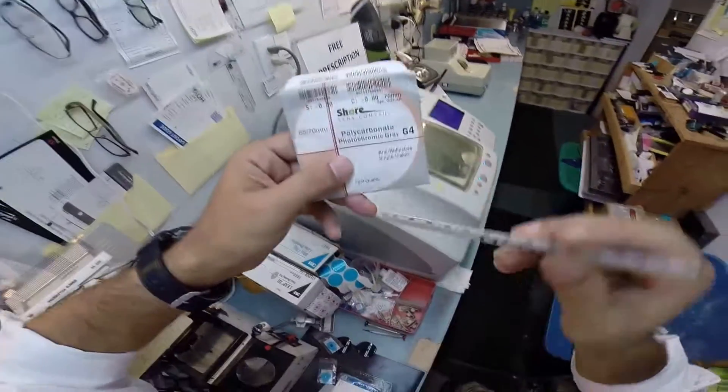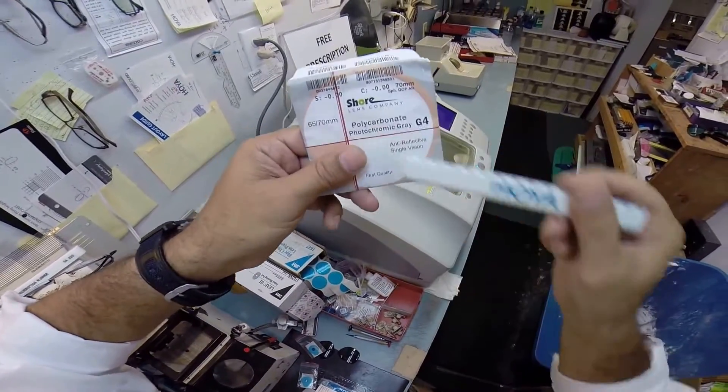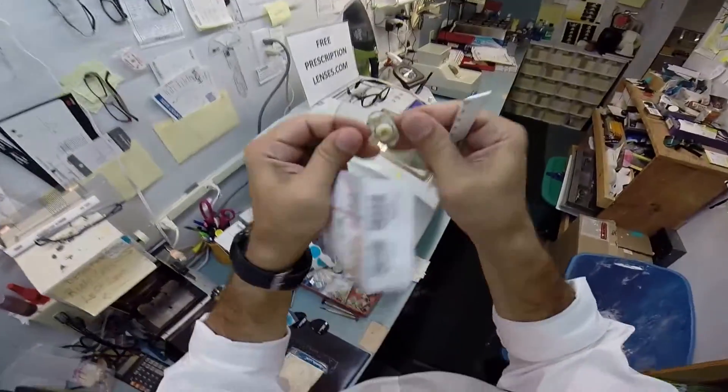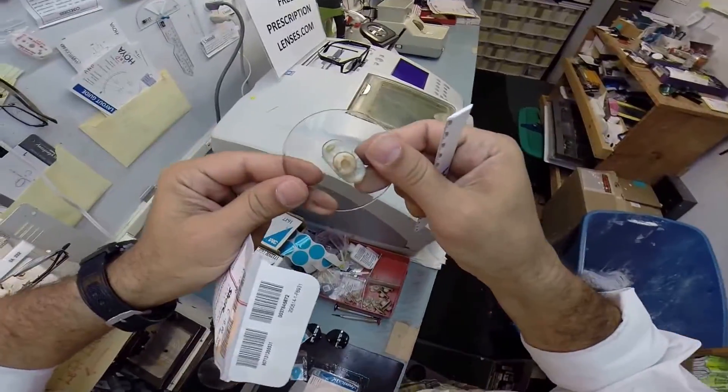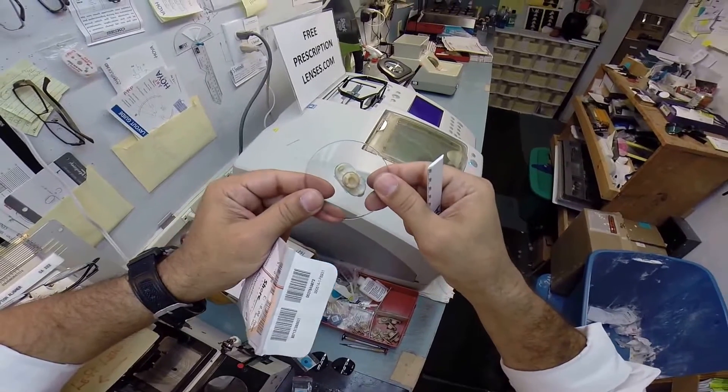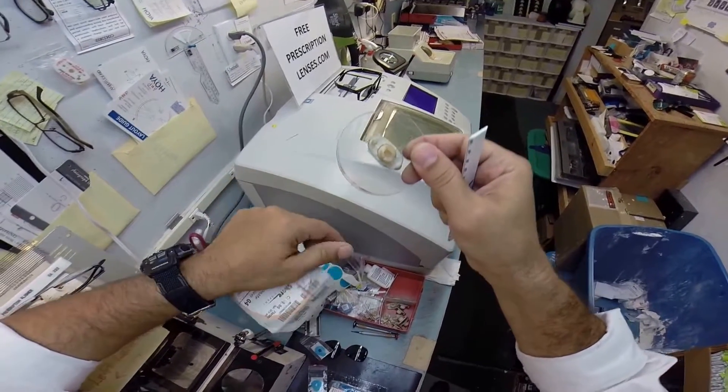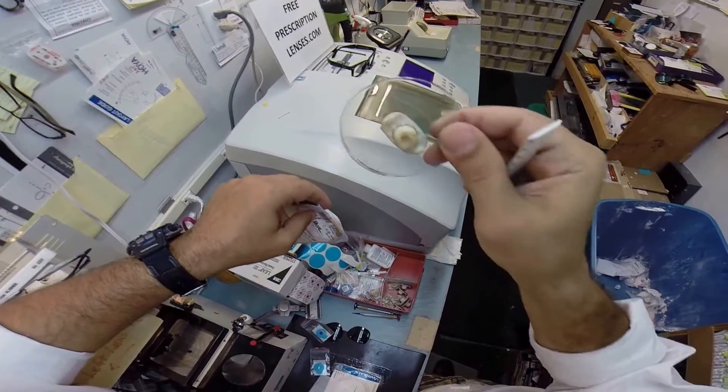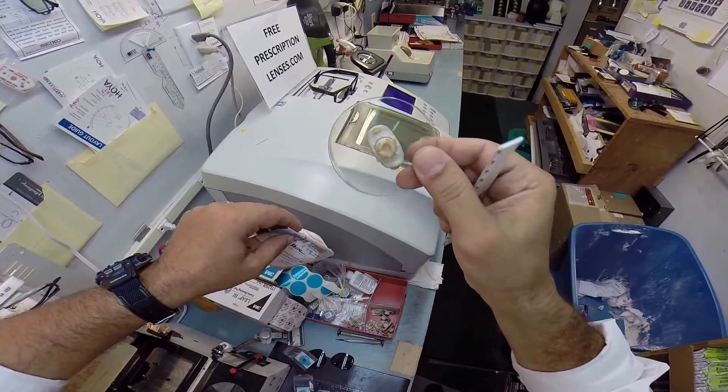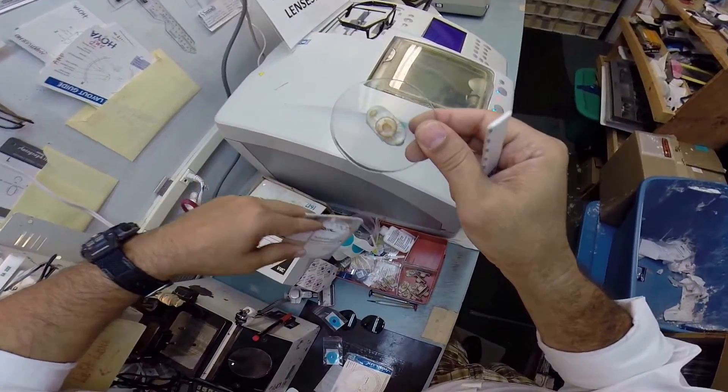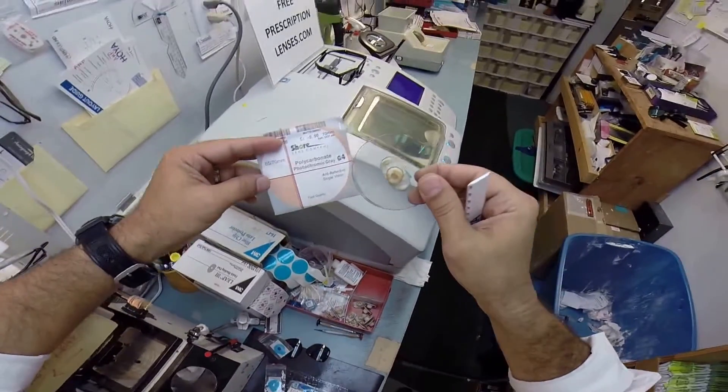Your lenses are made out of polycarbonate. Polycarb is 40% thinner and lighter than regular plastic. It is virtually unbreakable, which is going to be very important while you're riding your motorcycle. It's also bulletproof up to 22 caliber.